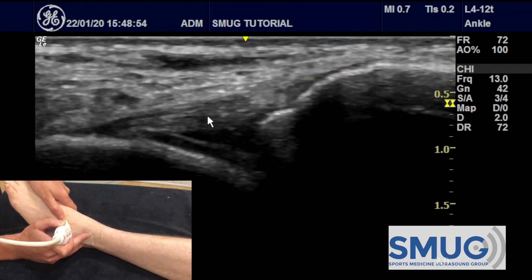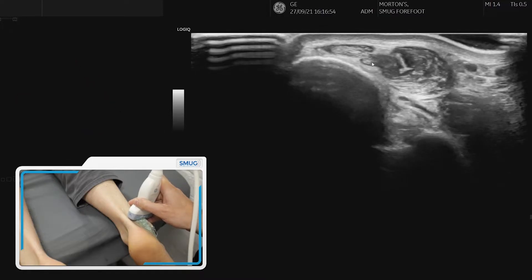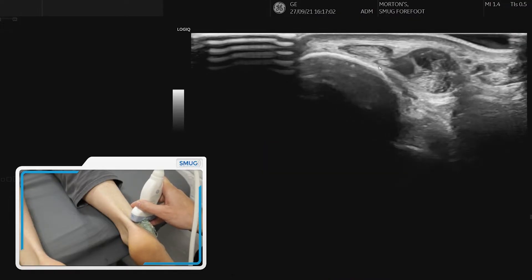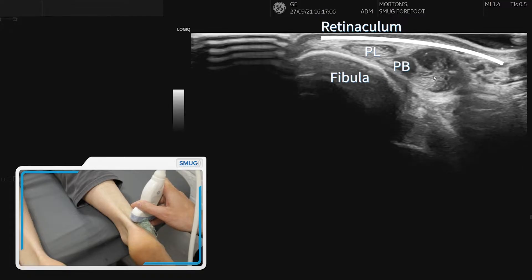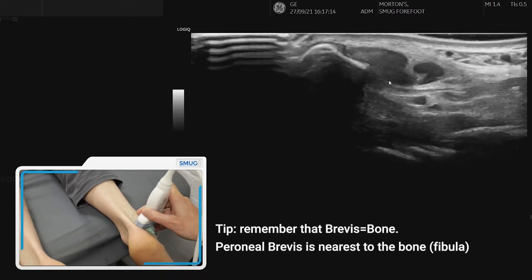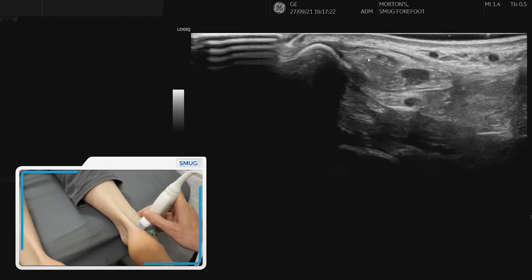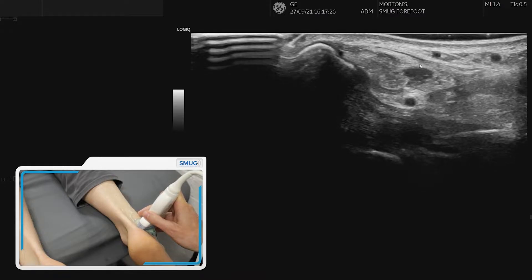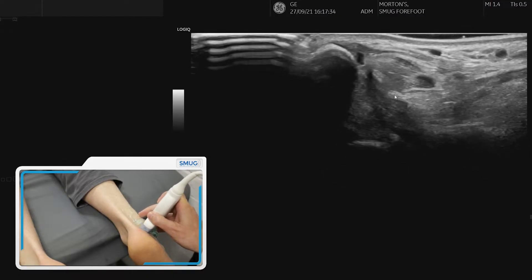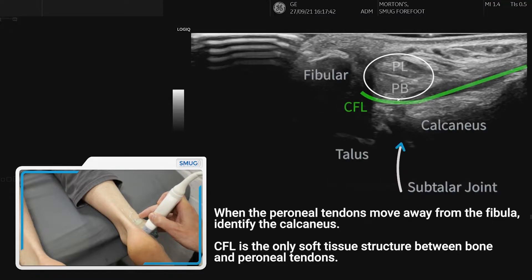To assess the calcaneofibular ligament, first pick up the peroneal tendons approximately five centimeters proximal to the lateral malleolus — use plenty of gel for good contact. Peroneus longus is at the top and peroneus brevis is underneath, with the muscle belly of peroneus brevis sitting right next to the bone. As we follow the tendons down, tilt the probe to avoid anisotropy. You can see peroneus brevis tendon, peroneus longus on top, and the superior retinaculum nicely. As the tendons come away from the fibula, our focus shifts slightly further down to the calcaneofibular ligament underneath them.